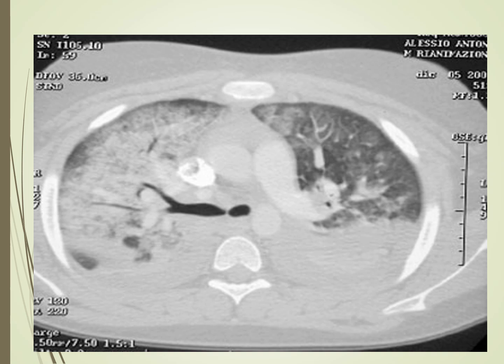This is a perfect picture of a patient with ARDS, and this is an actual CAT scan, and it shows all collapsed alveoli at the dependent region of the lungs. For example, I'm going to show you the circle. All of this area right here is collapsed alveoli, and that part of the lung is not taking part in gas exchange.